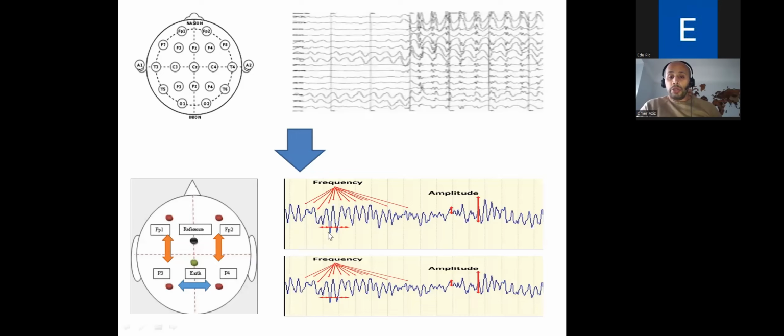The CFAM is looking at just two electrodes, so looking at the right and left hemisphere. For example, this entire EEG strip might take like 12 seconds, but if we're going to use EEG as a point of care for use by the intensivist, that's too complicated for us to analyze because it's reams and reams and reams of data, and we're not actually trained to do so. So we try to break that up into a lot simpler form, so the intensivist can use the CFM as a point of care monitor.